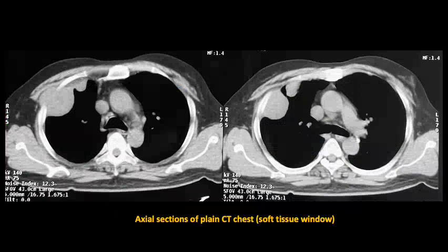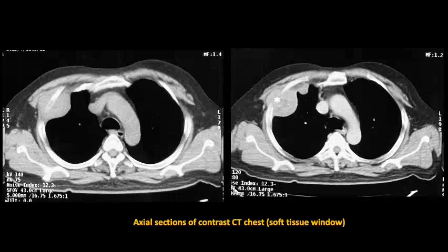Contrast-enhanced CT scan showed a well-defined homogeneously enhancing isodense pleural mass along the anterolateral aspect of the chest wall. There was loss of the extra-pleural fat. There was no evidence of any rib invasion.